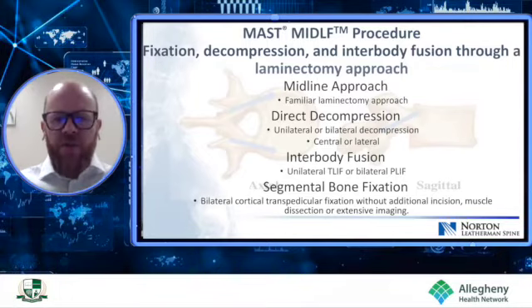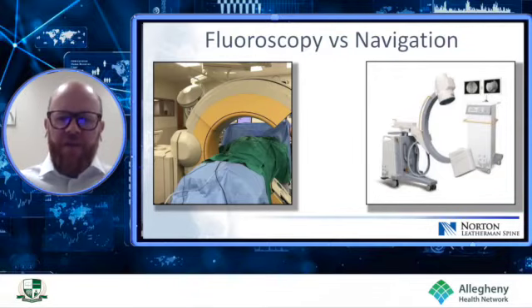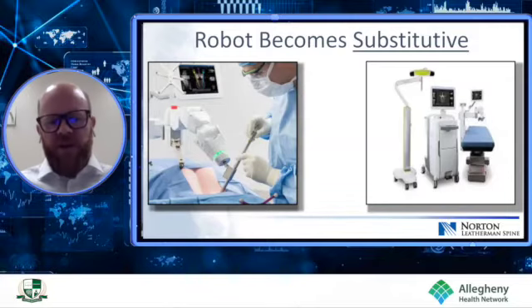And what I fell into was a couple reasons why this is a phenomenal way to introduce this in your practice without being super disruptive with this additive layer of technology. Number one, cortical screws, nobody freehands them, right? You have a cortical channel. You don't have this big cancellous channel where you can tactilely feel if that screw is going in the wrong position. So people typically use fluoro or NAV, right? And I was using NAV at the time. My robotic system became a substitute. So I didn't just layer in more steps into my workflow. I took a step away, I added this in. And what that did is it shortened that learning curve out of the gate. So that's number one reason why I really fell in love with robotic assisted cortical screws.